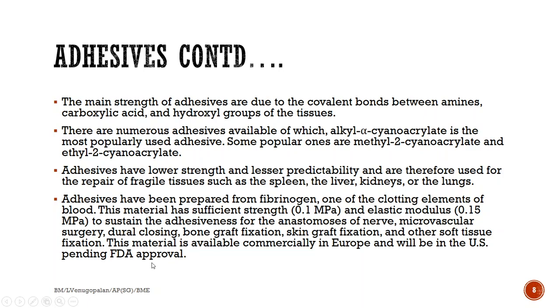So there are numerous adhesives available, but alkyl alpha cyanoacrylate is the most commonly used group of adhesives. Some popular ones are methyl 2 cyanoacrylate and ethyl 2 cyanoacrylate. These are the two very popularly used chemical substances as adhesives.